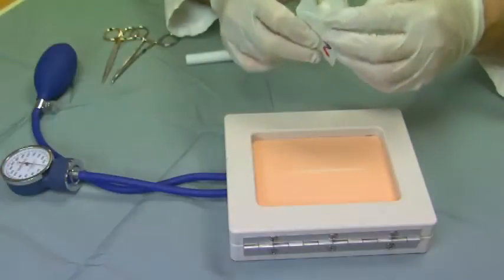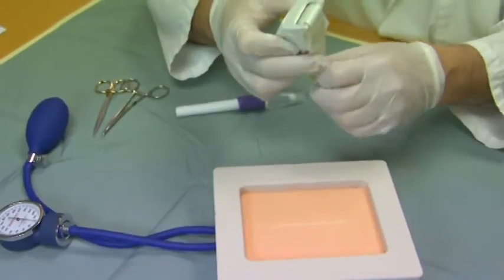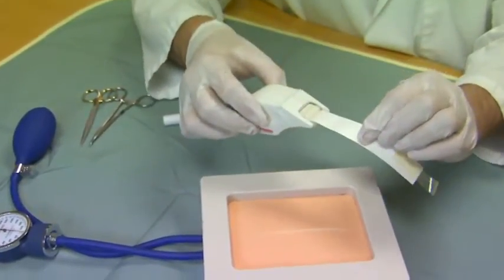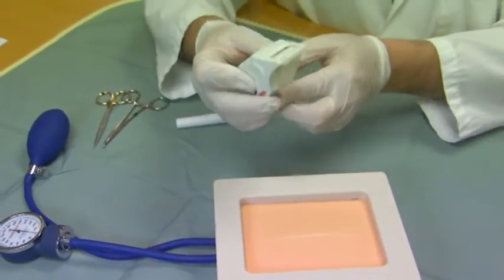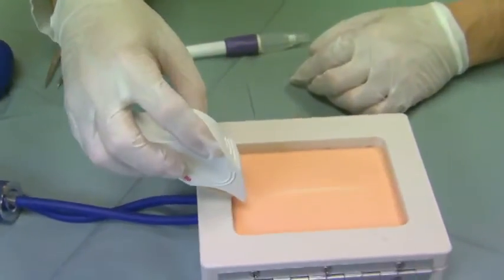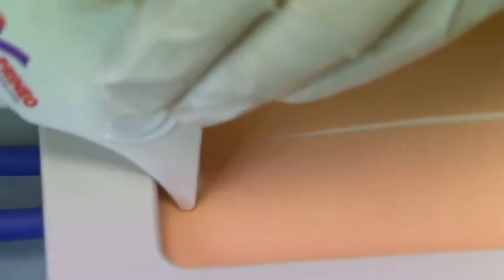The mesh applicator contains a leader which is taped underneath the device. To start the mesh application, we pull the leader out until the mesh is exposed, fold it underneath the device, and then start applying it at the edge of the incision, approximately one centimeter distal to the incision.